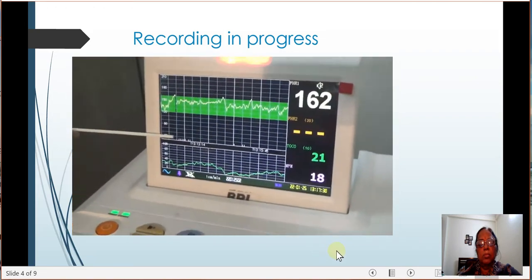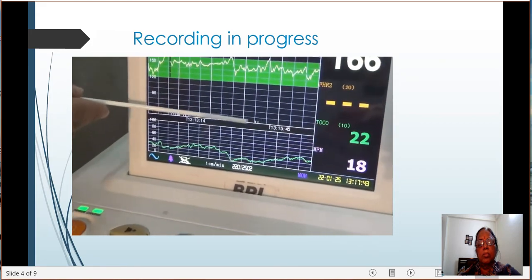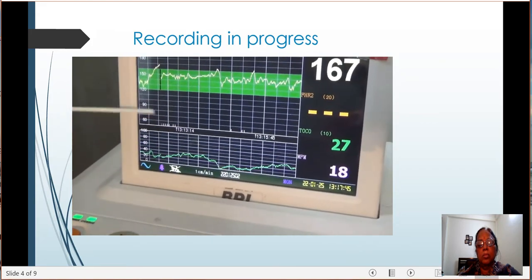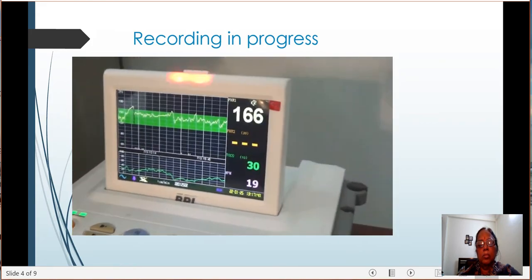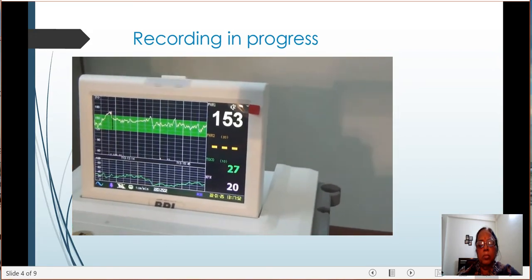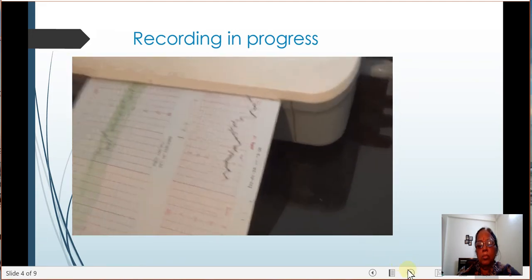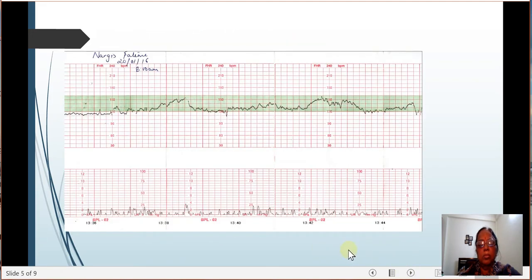The third thing we can appreciate is these small yellow lines on this CTG graph. These are representing the fetal movement which was being marked by the fetal movement counter by the patient. These representations can be taken in a print form in the NST graph. Here you can see the graph.